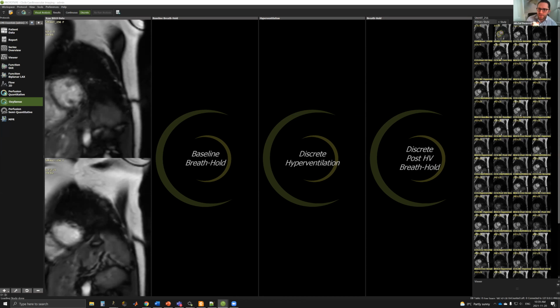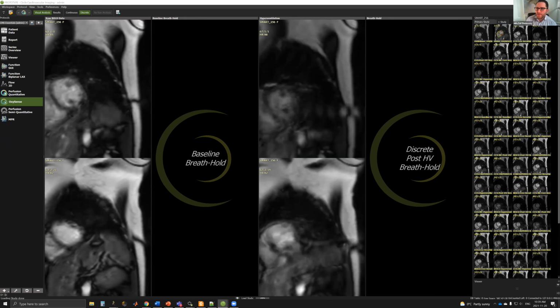For now, we're just concentrating on the myocardial pixels. So the contouring is fairly important. And you bring up a very good point of the partial voluming effects. Those become kind of critical when you're looking at a polar map representation. So when you're averaging a big amount of pixels together, if you have just a few of them inside of the blood pool, your whole AHA sector can be artificially enhanced or amplified.